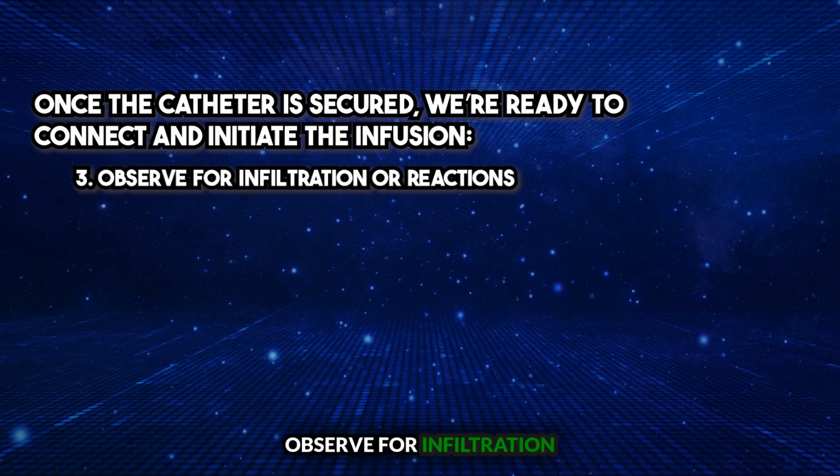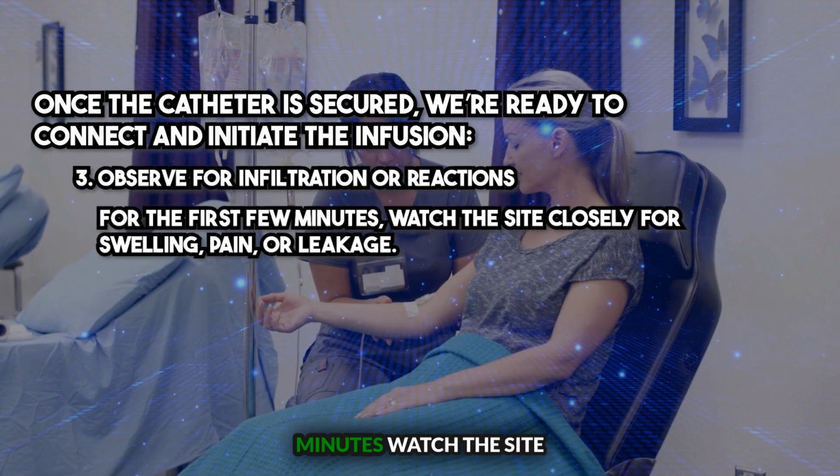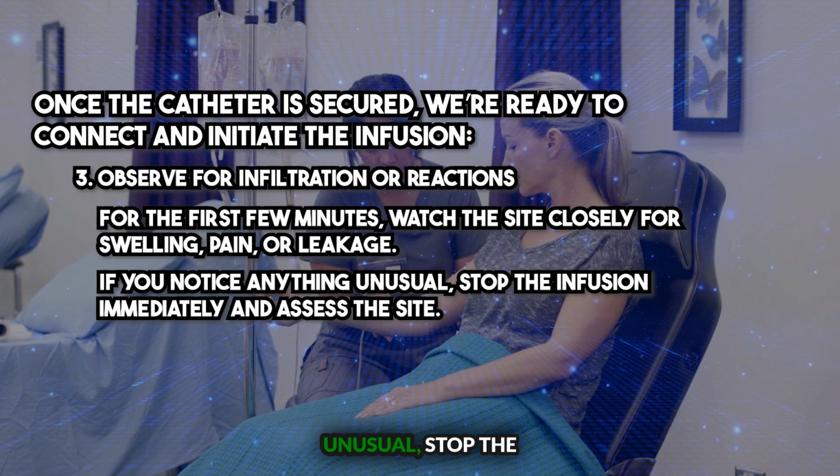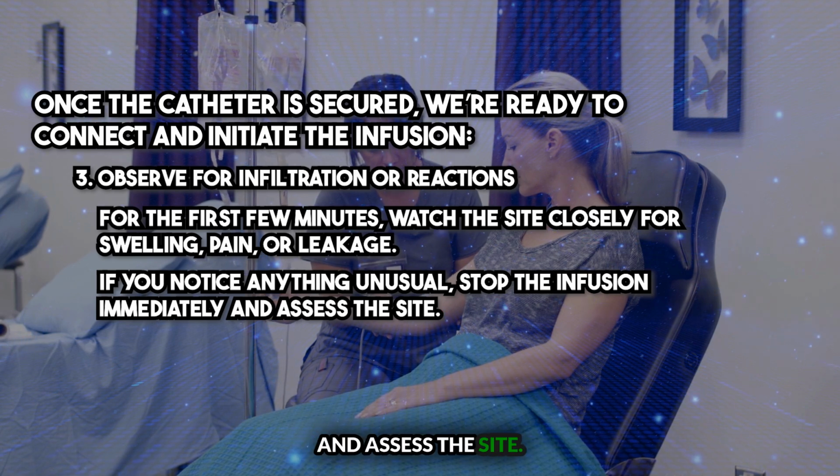3. Observe for infiltration or reactions. For the first few minutes, watch the site closely for swelling, pain, or leakage. If you notice anything unusual, stop the infusion immediately and assess the site.